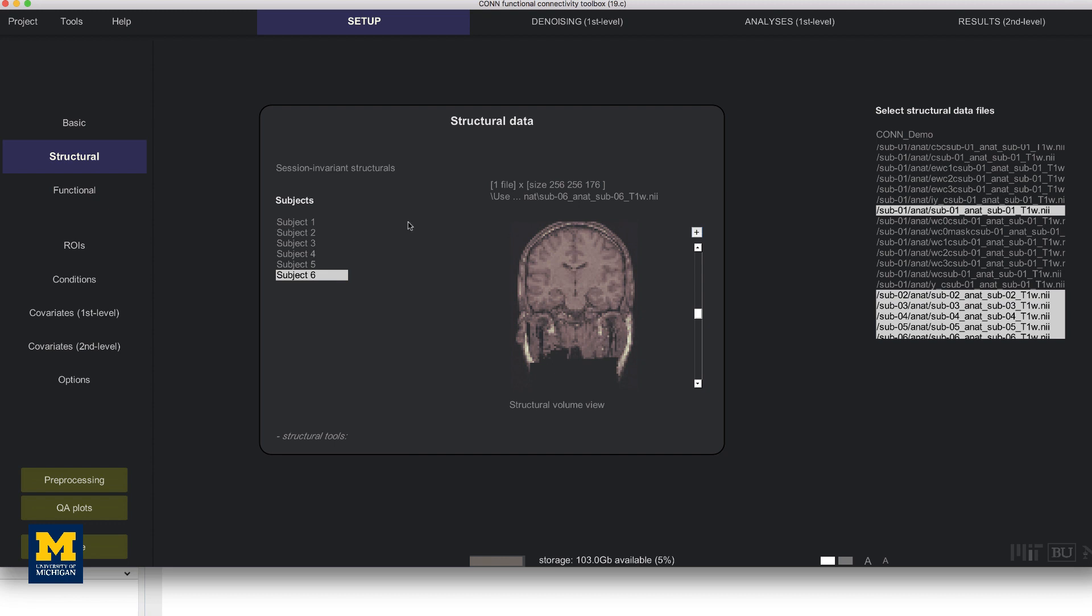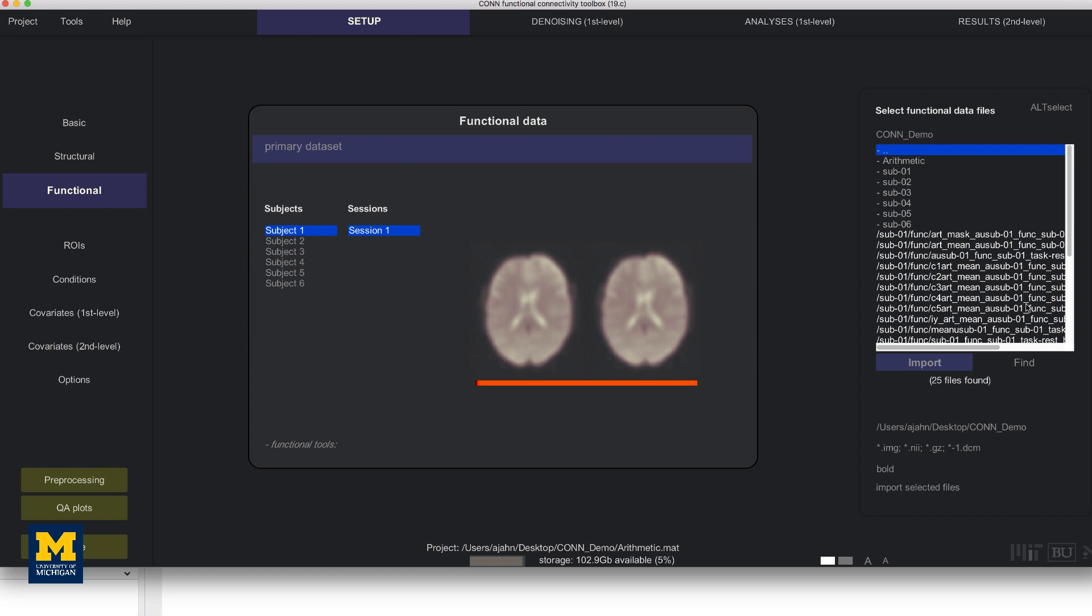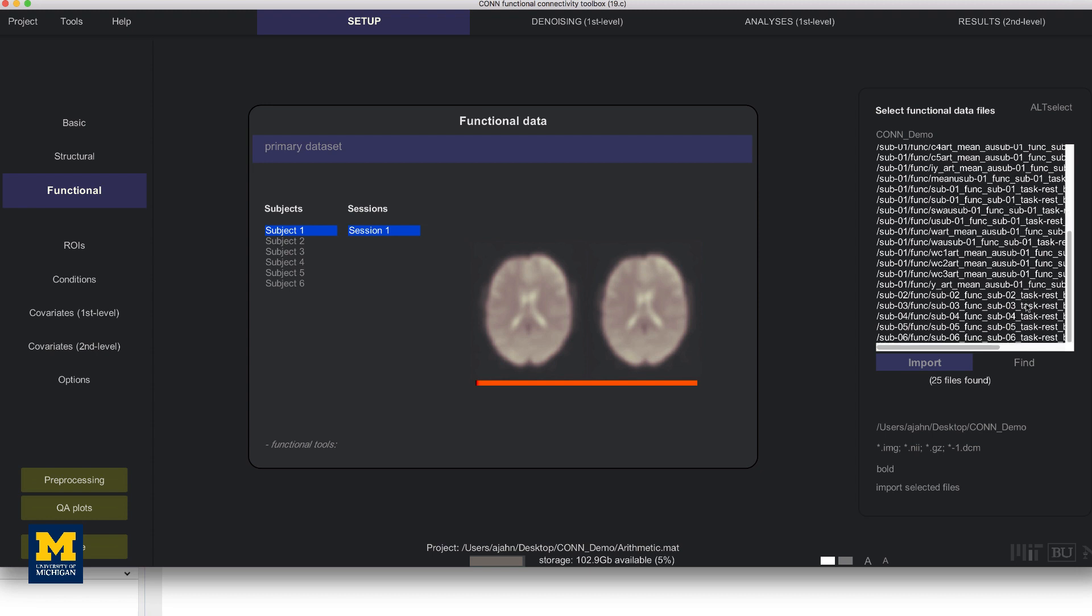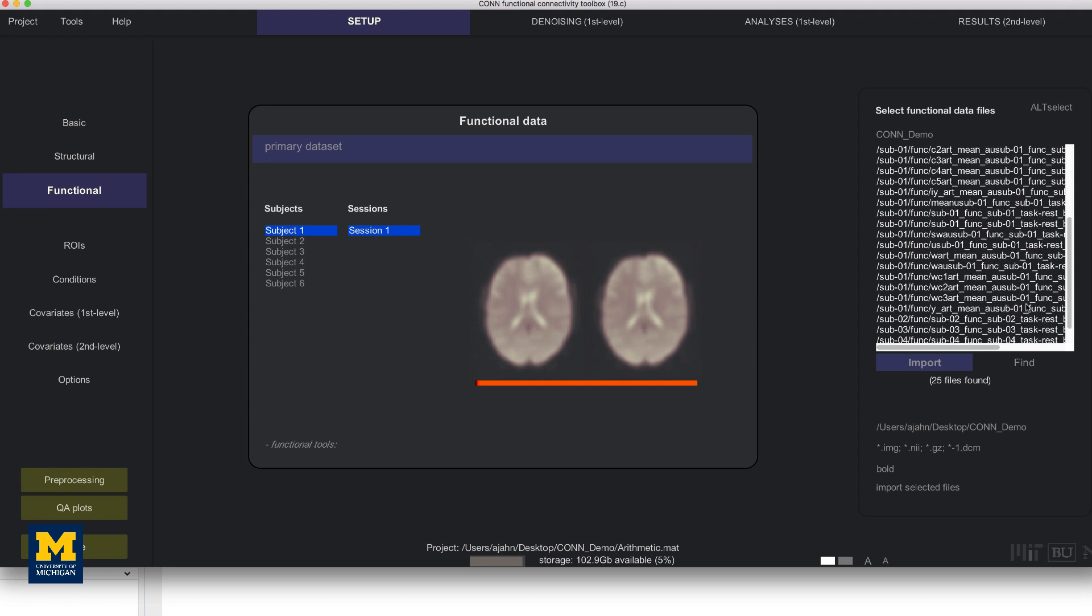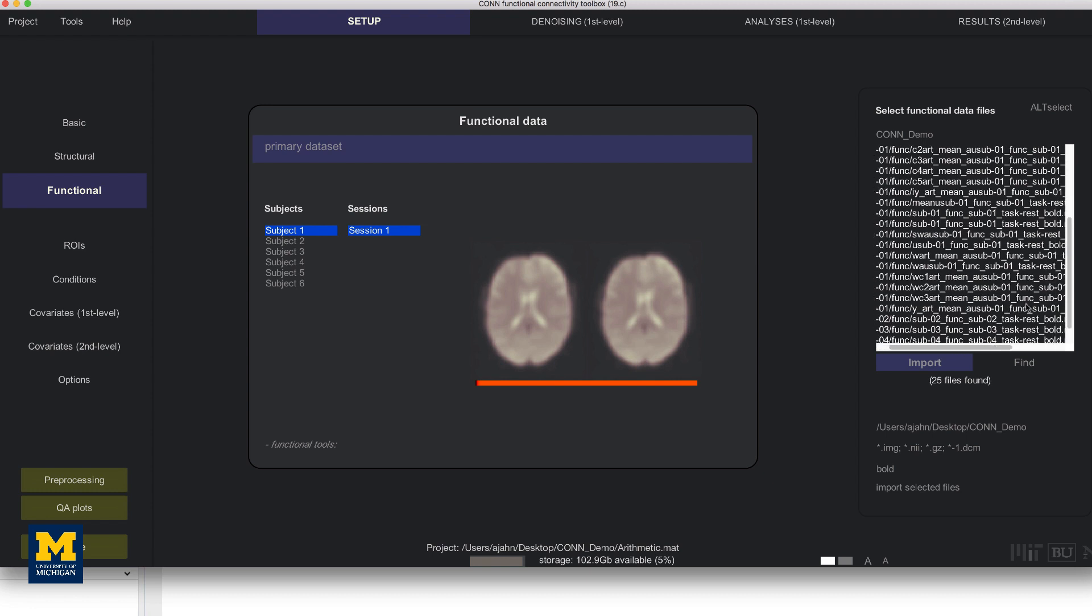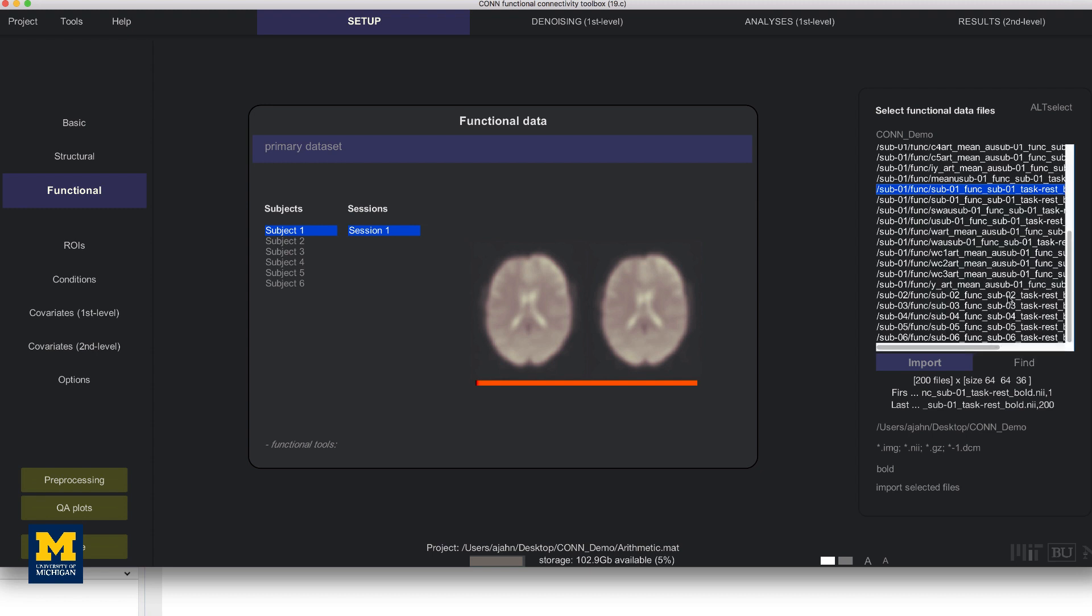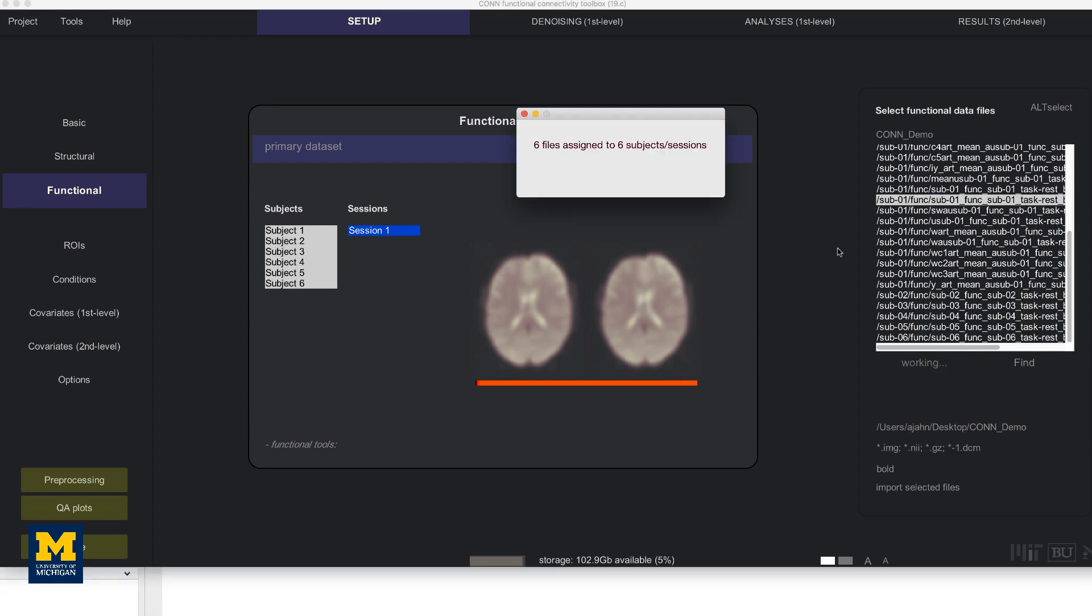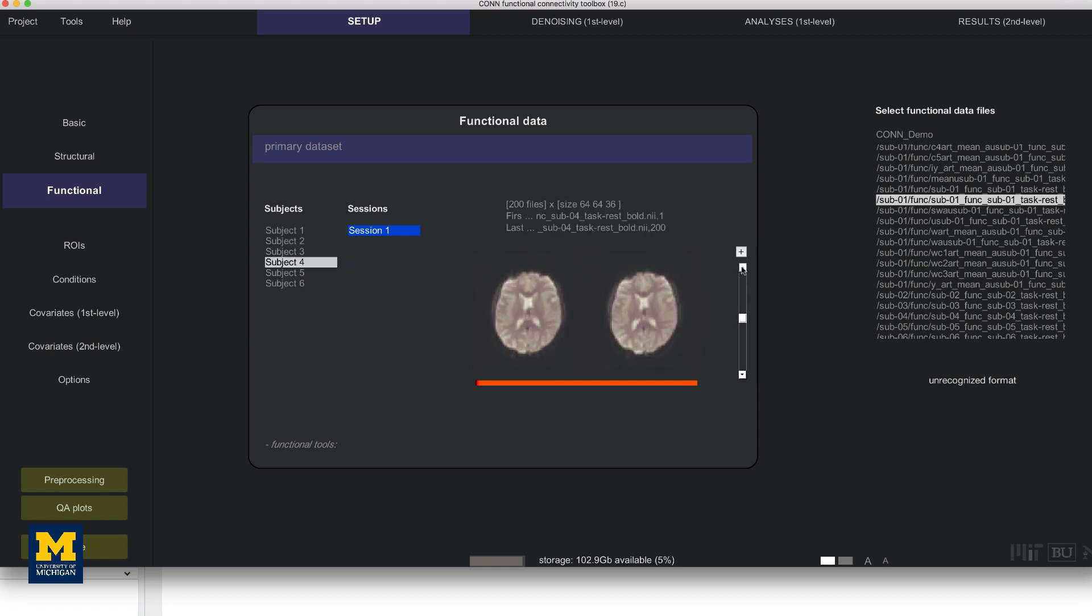Now do the same procedure for the functional images. Click on the functional tab and use the find filter to look for any images in your directories that contain the string bold. Again, sub01 has already been processed, so we have a lot of files. The original one should be right here, and then we select everybody else as well. Make sure to highlight all the subjects over here by shift and clicking, and then click import. After a few moments, you should see a pop-up window that says six files assigned to six subjects. Again, take the time to look at each subject to make sure that there are no anomalies.